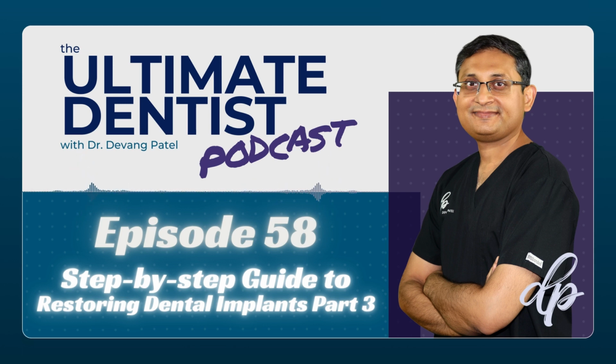Now, when you are sending a prescription to your laboratory, what kind of information do you want to include? First of all, you need to make sure you tell them the type and brand of implant. You need to tell them the implant size or connection size. So if it's, let's say, a BioHorizon 4.2 millimeter width implant, you don't need to tell them the height because they don't really need to know the height. It's just the width and the connection size. 3.5 millimeter is the connection size.